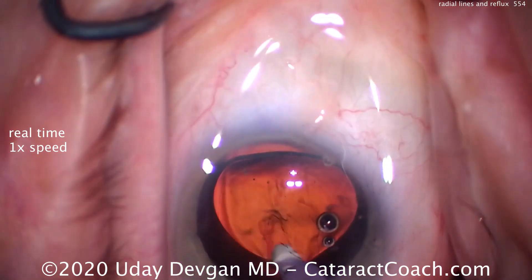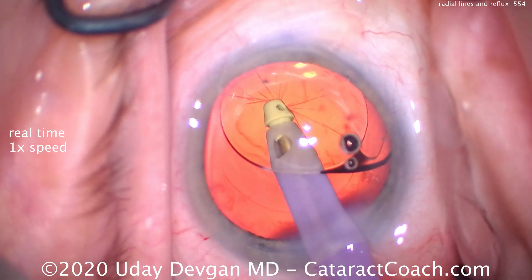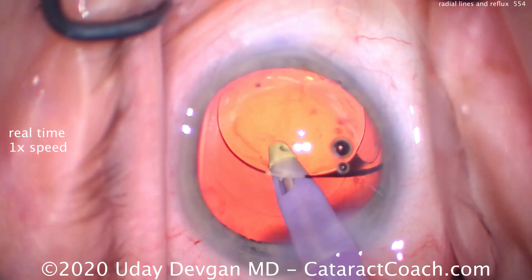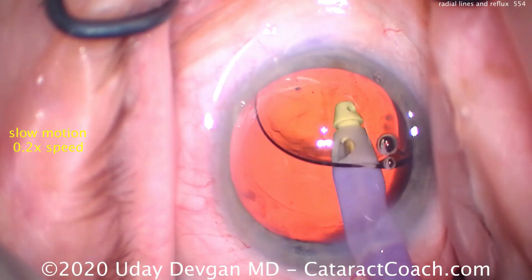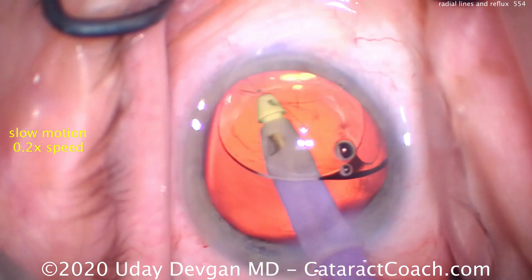Watch carefully — here's what happens while removing viscoelastic: we get some radial lines. We release, and now we can continue. Let's watch again in slow motion: as we aspirate the viscoelastic out, we get part of the capsule stuck in the port — that's the radial line.